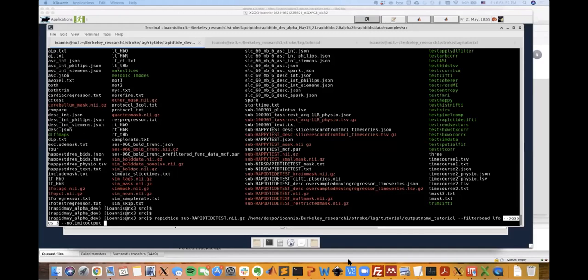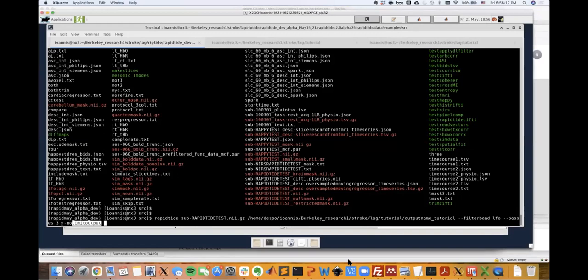So basically the idea behind this is to refine the initial global regressor and make a better regressor that is eventually going to be used for cross-correlating all of your data. This option just tells you how many times this is going to happen. And as I explained before, this is an output option that tells you to output all of the rapidtide data.